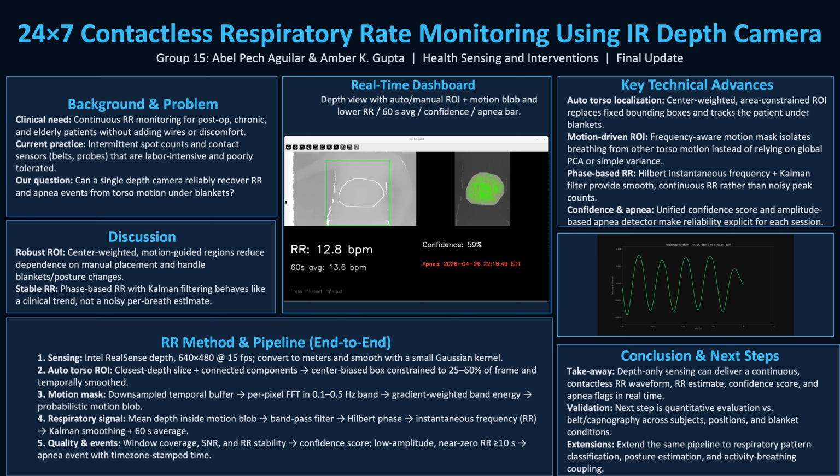With that, I'll hand back to Abel to close with the big picture and where we would go next from here. Thanks, Amber. To close, I want to connect back to the original proposal and where this could go. In the proposal, we promised a real-time RR dashboard, an accessible architecture, and early apnea detection. Over this semester, we iterated through fixed ROIs, grid selections, PCA, and finally arrived at this motion-guided, phase-based pipeline that now runs live with the RealSense camera.